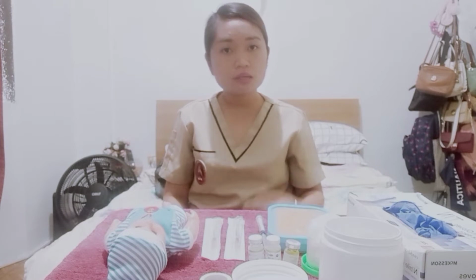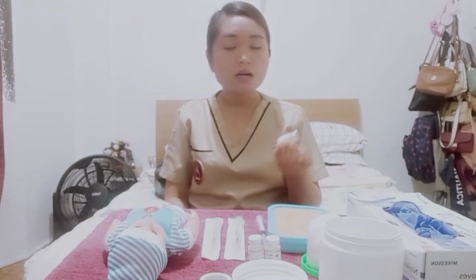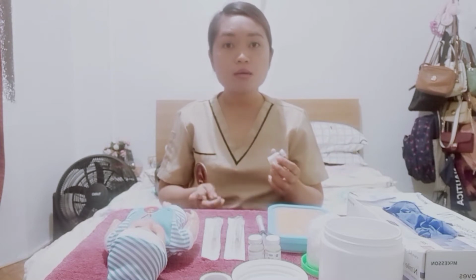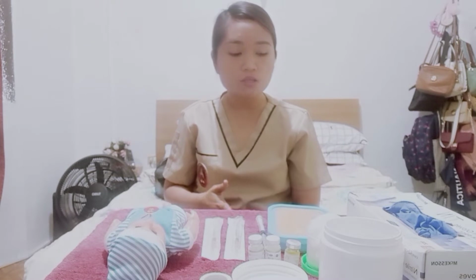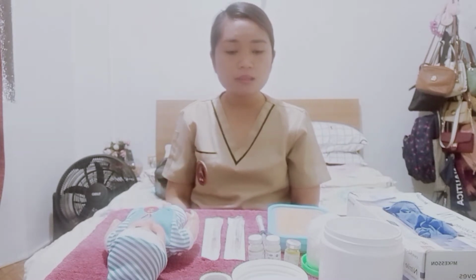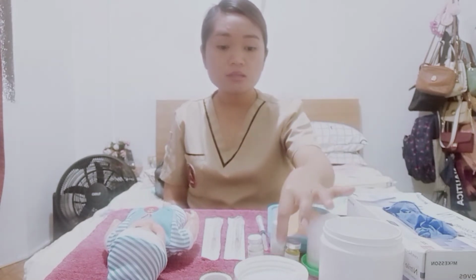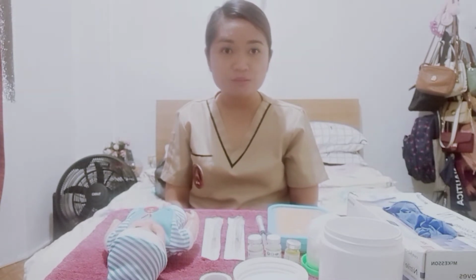So of course, for the first intervention, we get the medication, ensure that we've gotten the right medication from the refrigerator, check the expiry date, and at the same time, we maintain the cold chain. Okay. And then after that, we prepare all the necessary equipment that we are going to use for the vaccination. So of course, we'll be needing the vaccine. Okay, we'll be needing a diluent, especially if we need to reconstitute. Obviously, it's not going to be needed for a pre-filled syringe.